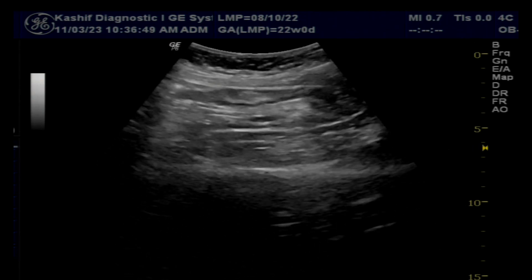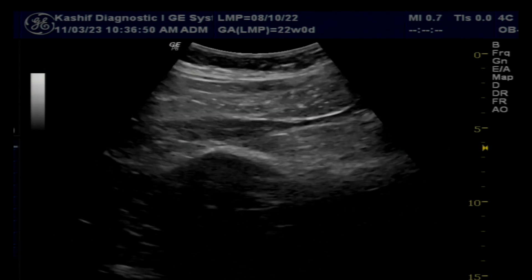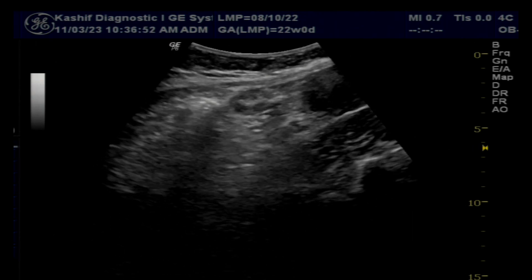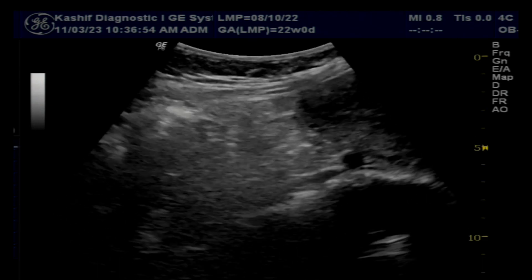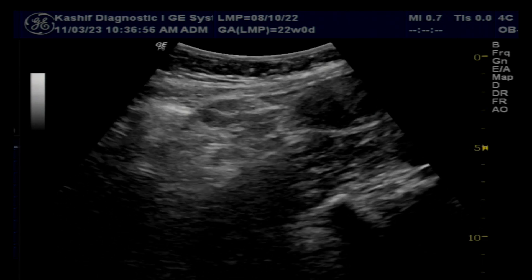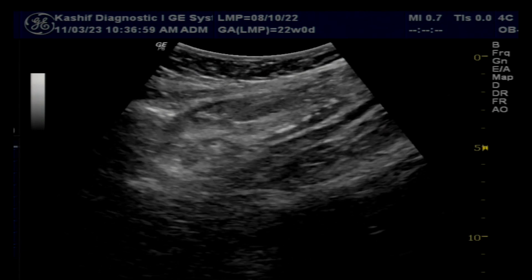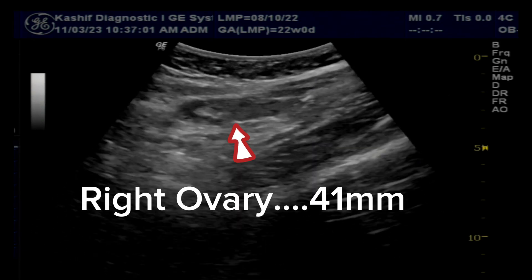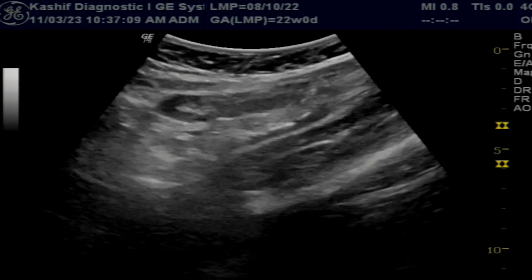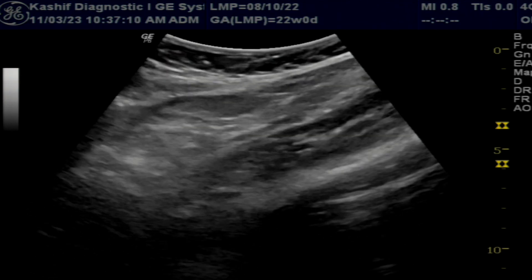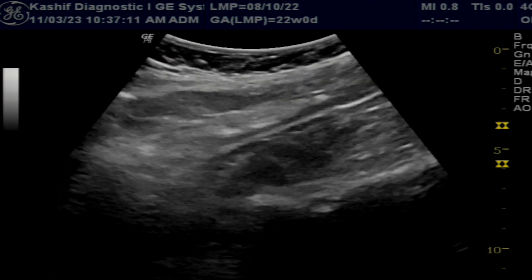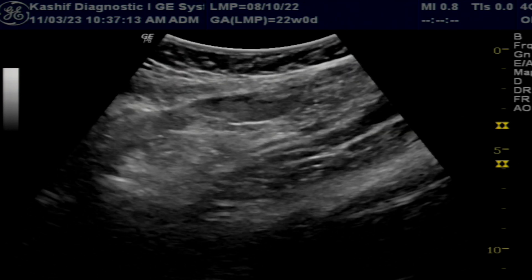In this scan, both ovaries are visualized and are normal in size — sizes are noted in the video. Both ovaries have small follicles, 12 or more in number, measuring 3 to 5 millimeters.